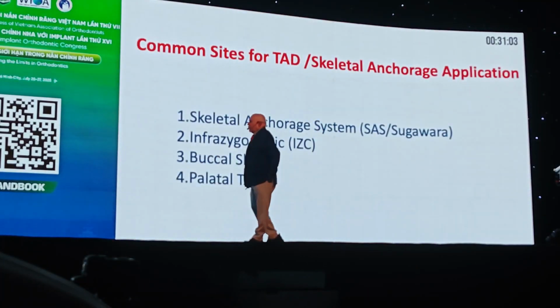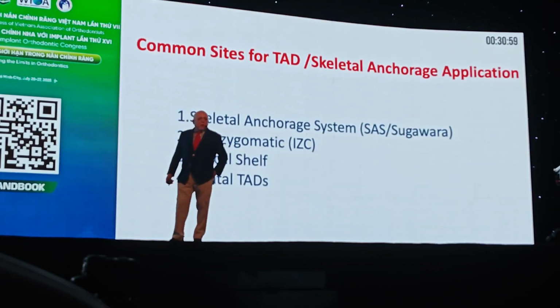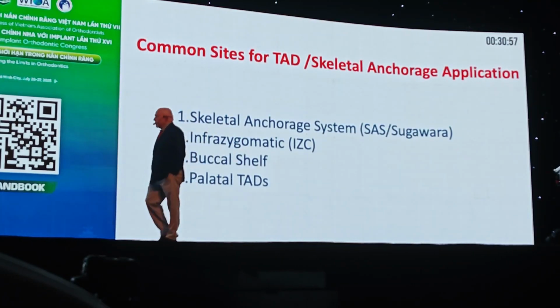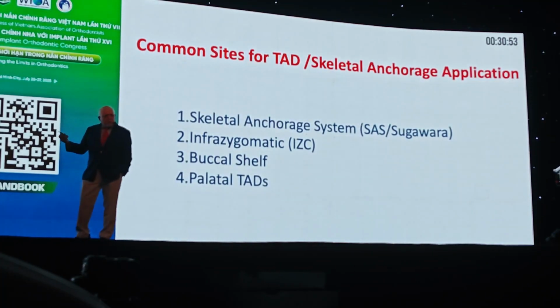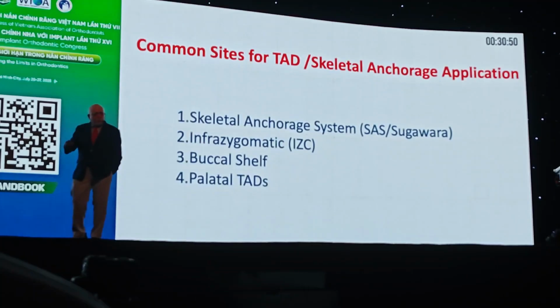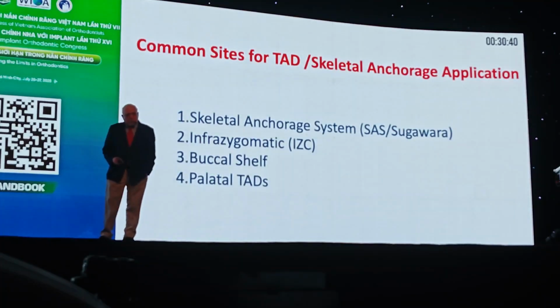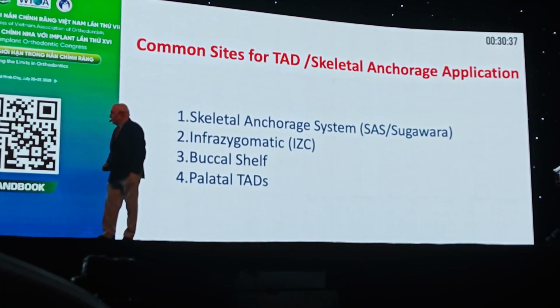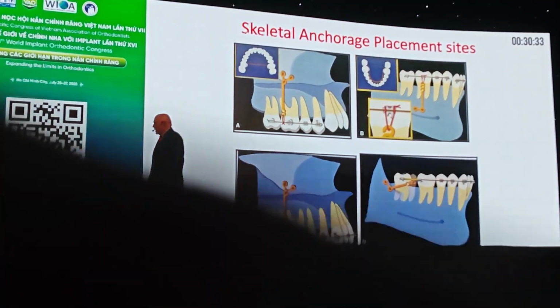Now, what are the common sites for TAD and skeletal anchorage application? One is my friend Dr. Sugawara's skeletal anchorage system. In the US, it is rather difficult to use because you need a periodontist or oral surgeon to do it. Cost increases. Then there are infrazygomatic TADs, buccal shelf TADs, and palatal TADs. You are going to hear from Dr. Benedict Lucas about palatal TADs a lot now. I'm going to talk a little bit about infrazygomatic and buccal shelf TADs.